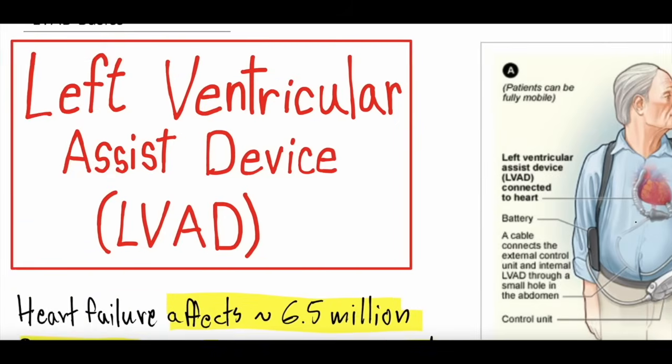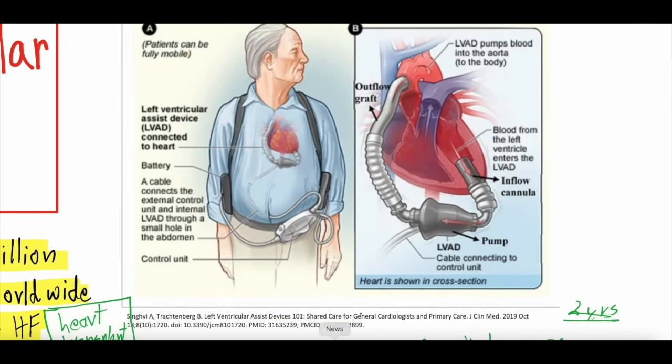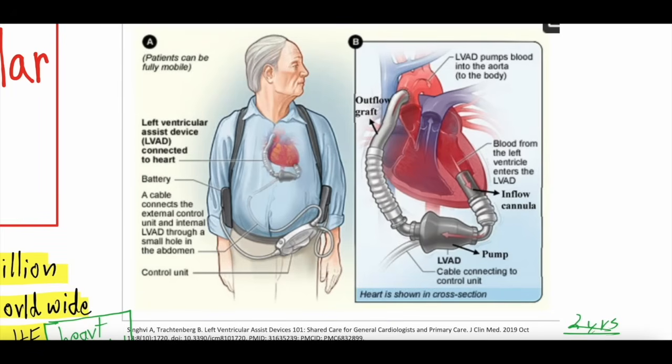So I'm going to zoom into this graphic over on the side here, and we put a citation below it. It's not our work, so we'll link this study in the video description if you want to go to it, but credit where credit's due, this is their image. But it shows a pretty decent outline of what these devices look like. So hopefully this looks like the heart, right? This is the right atrium, right ventricle. This is that pulmonary outflow tract that goes to the lungs, right? Then that blood comes back into the left atrium, left ventricle, and then here's that aortic outflow tract, aortic arch.